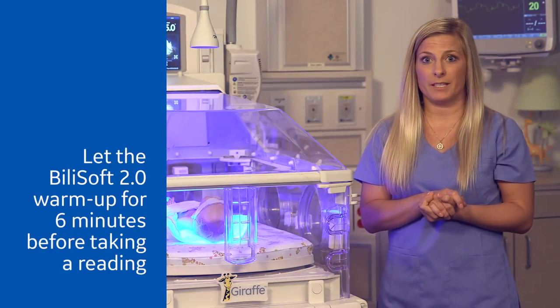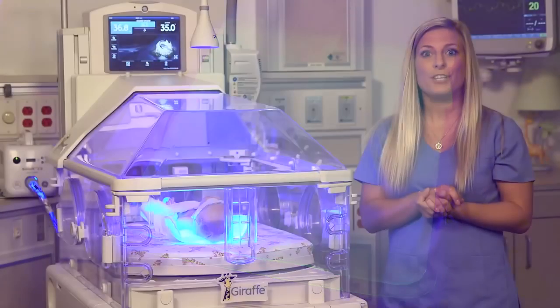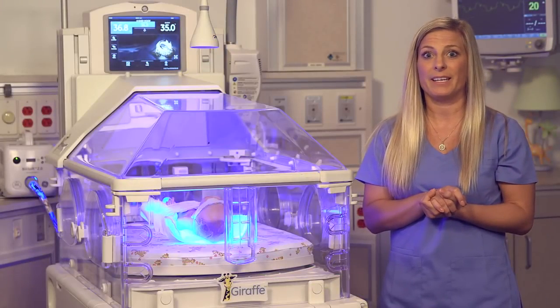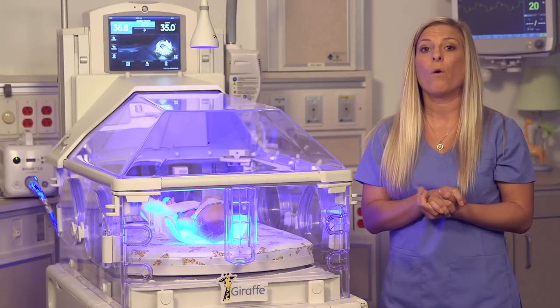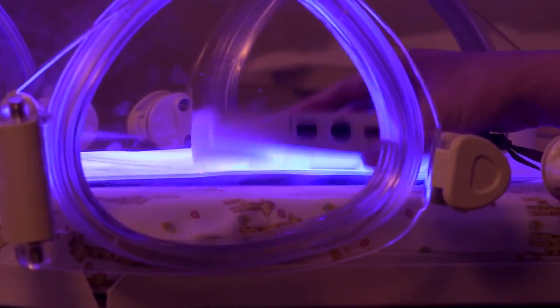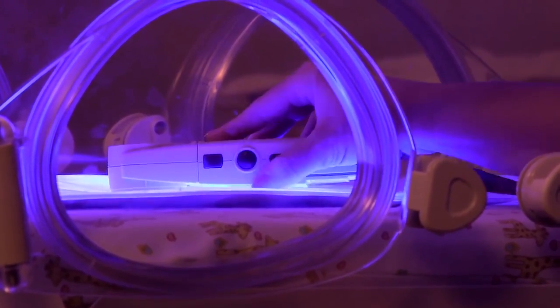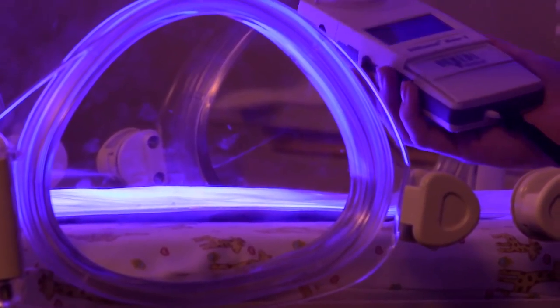While you are waiting 6 minutes for it to warm up, place the fiber optic light pad on a flat surface. Do not place the fiber optic light pad inside of a BiliSoft pad cover or BiliSoft Nest at this time. Use a calibrated bilimeter that is approved for the BiliSoft 2.0. I'm using the approved Omeda Medical BiliBlanket Meter 2.